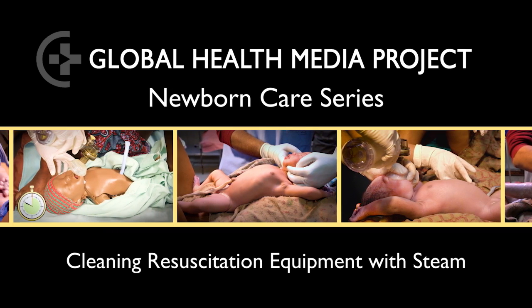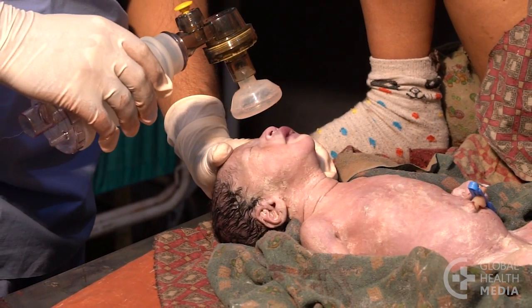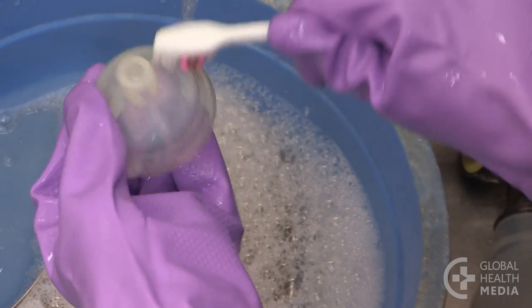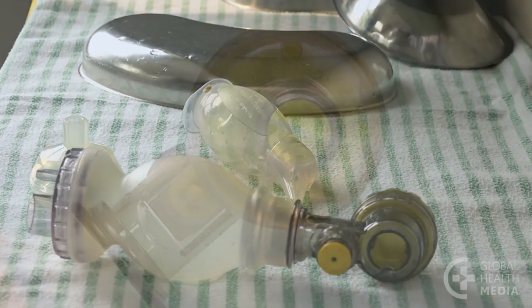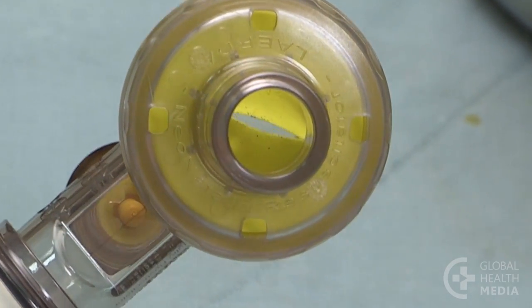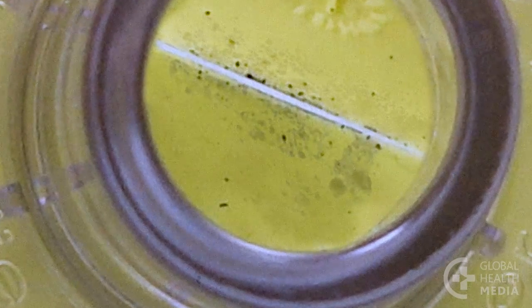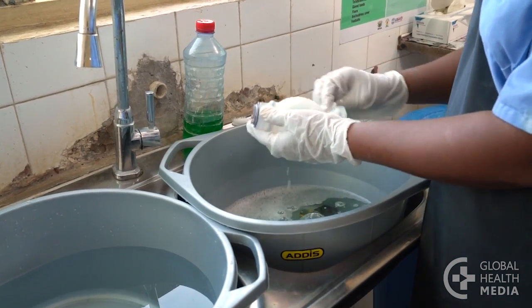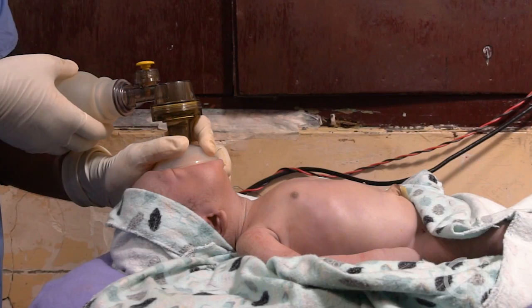Cleaning Resuscitation Equipment with Steam. During use, resuscitation equipment becomes contaminated with the body fluids of mother and baby. If you simply wash your equipment with soapy water and set it to dry, the equipment may appear clean. Harmful germs, too small to see, may still remain. These germs can pass into a baby's airway leading to infection. This video will show the key steps of cleaning resuscitation equipment using steam to disinfect the parts. This will make the equipment safe for the next baby.